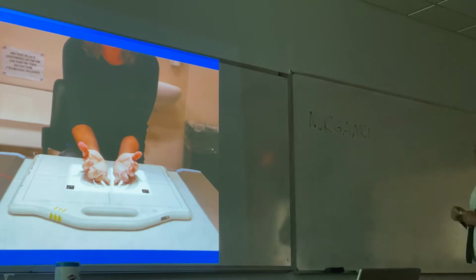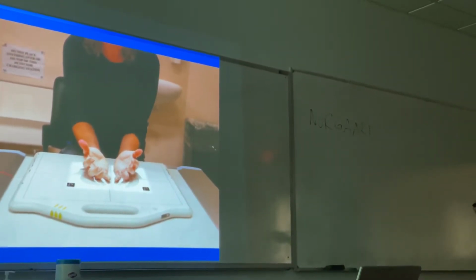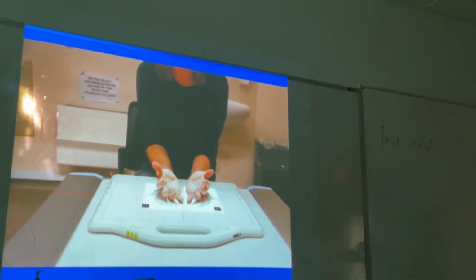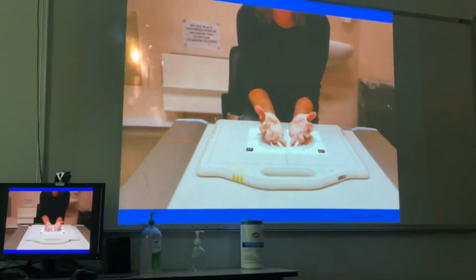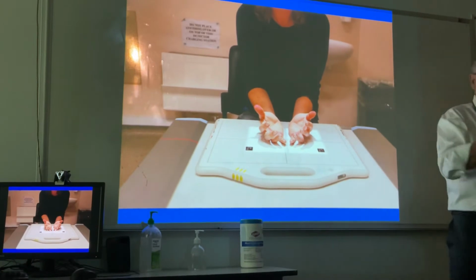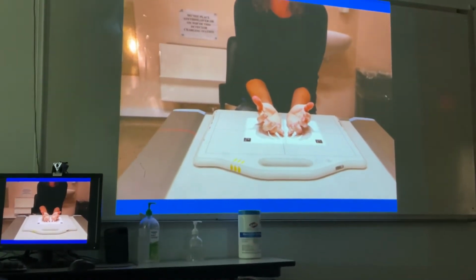Dr. Nordgaard, way back in the day, found with plain films that this presented the metacarpal heads best or better than the PA view, and that was for the detection of rheumatoid arthritis. They still use this, by the way. We're just saying there's another way to see that area more clearly to tell if there's rheumatoid arthritis.